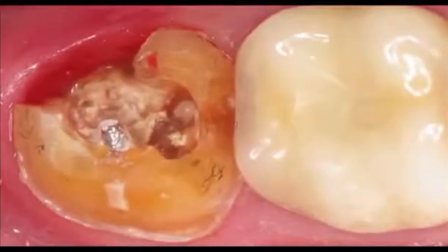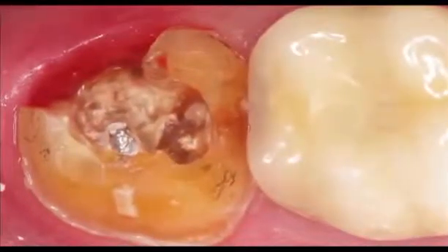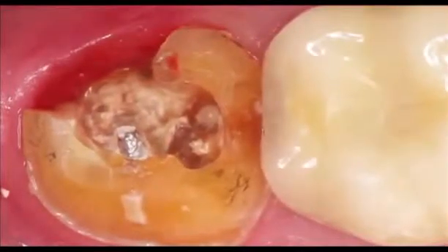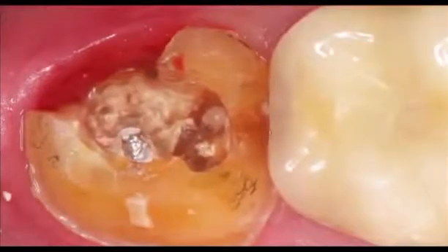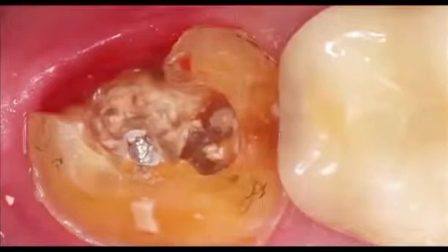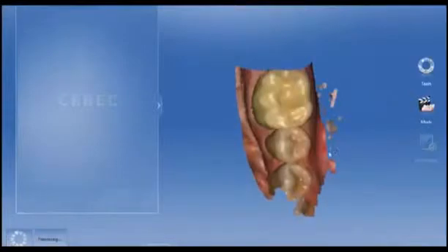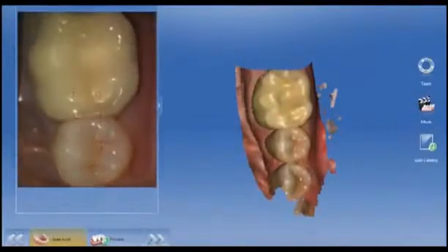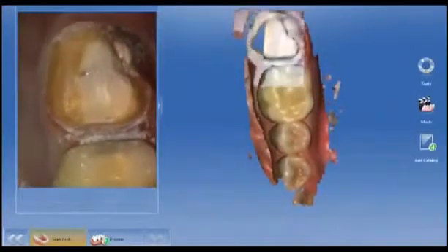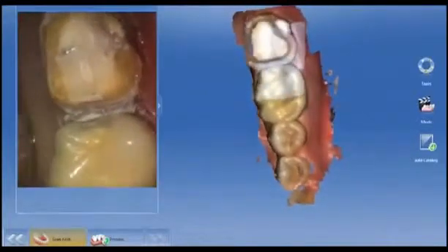Do we try to put a matrix around that, get way subgingival and seal it up? Or do we get rid of the gum tissue so we can get our margin all the way down for a physical impression? So this is a difficult situation, and one that I didn't think I was going to be in, because I didn't think the buildup was on the distal lingual cusp. Because I already had taken most of the quadrant, I just need to fill in the very end of it with the prep information. So you can see the distal lingual area where the cusp had fractured.